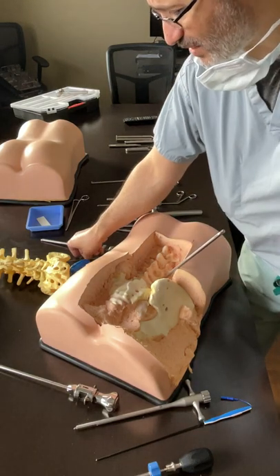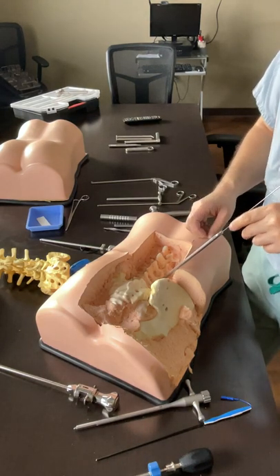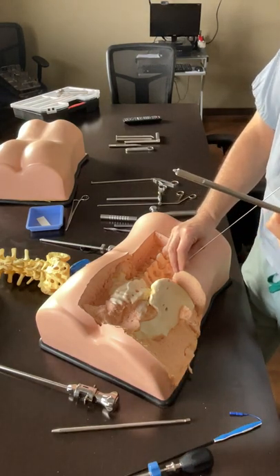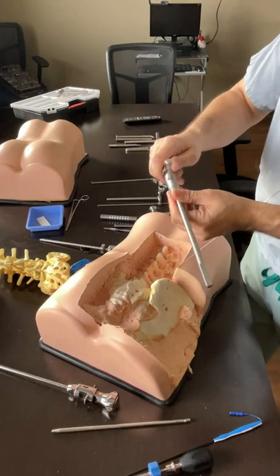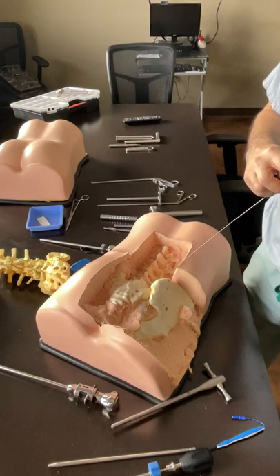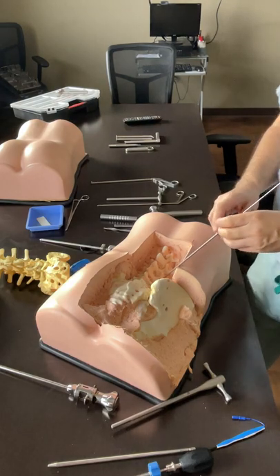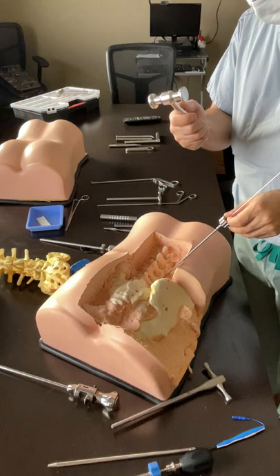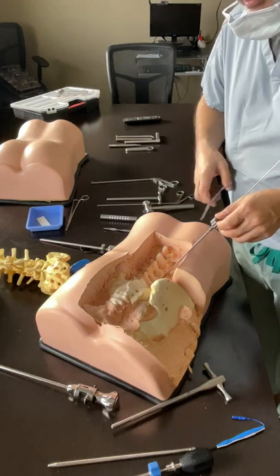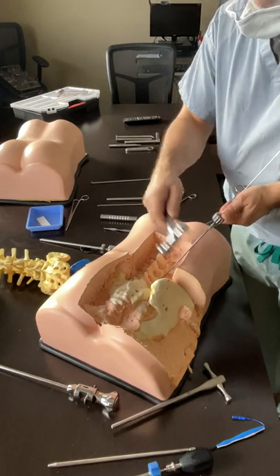You fill the cage. You can then put a K-wire over the inserter into the cage, take the inserter out, and put it back in if you want to reposition. If you want to take it out, you can disconnect, put it back in, reengage the cage, and either use a mallet with a slit in it and tap it out, or put a K-wire and a Kocher here and tap the cage out.